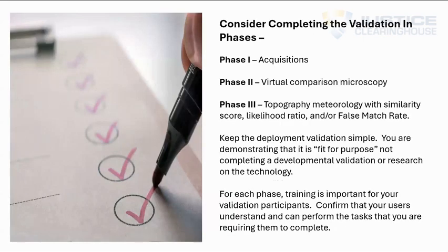So I would consider doing this validation in phases, where you're not bringing the system on and utilizing all of its capabilities, but rather a stepwise adoption of this new technology. And I've seen some other labs do this with great success.